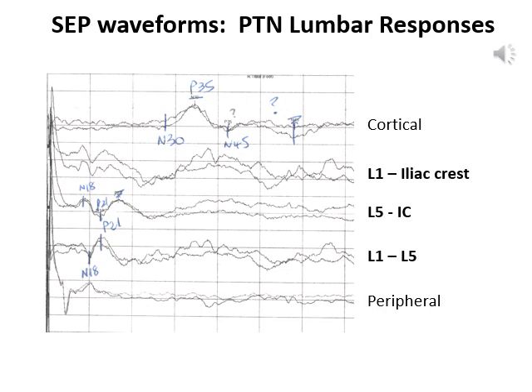The previous slide showed a very nice cortical and popliteal response. However, the lumbar responses were not so clear. In this slide, the lumbars are very well formed, and the cortical response shows a fairly typical individual variation. I have already mentioned that a typical variation for the cortical response is to only see the first peak, the N30 P35, which is what we see in this case, and the absence of an N45 P55 is an individual variation and not of clinical significance.